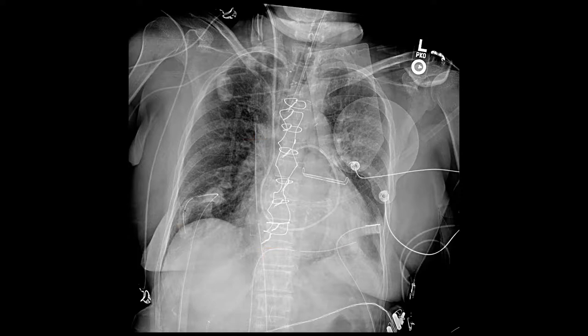What about this tube here and the tube on the other side of the chest? Those are chest tubes. They'll drain pleural fluid, and if the patient develops a pneumothorax, they can help treat that as well.